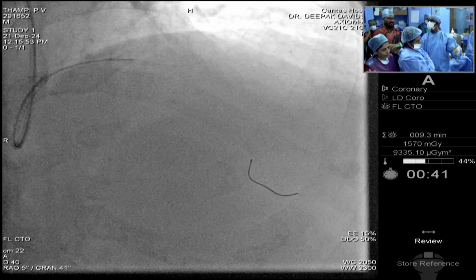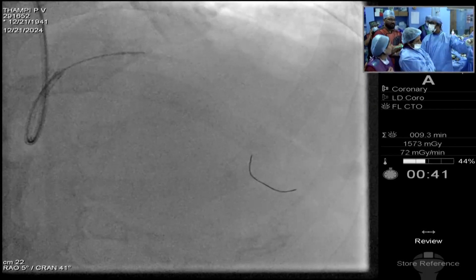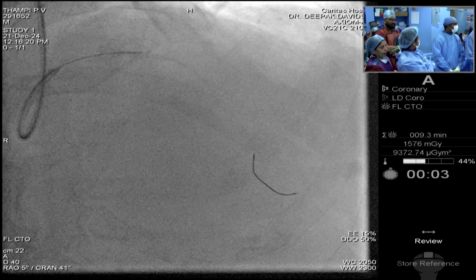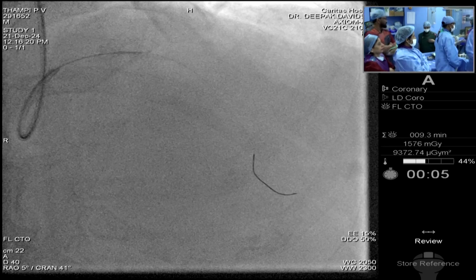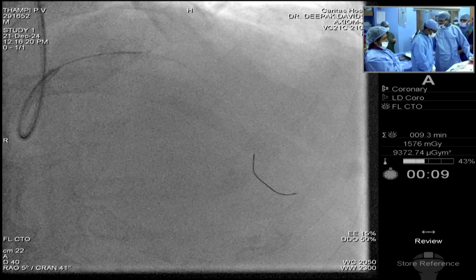We started with low RPMs, 80,000 RPM, and now we've just gone up to 120,000 RPM. Anjana, we'll do one more.